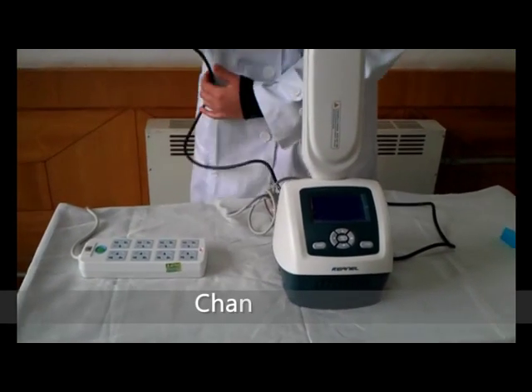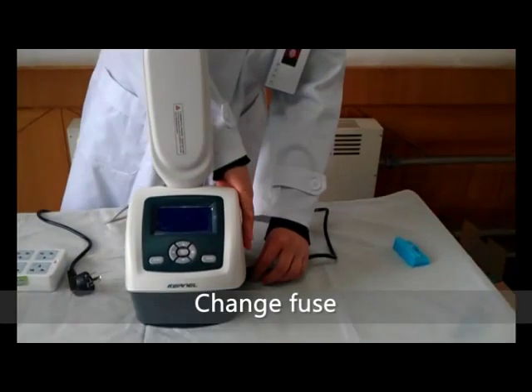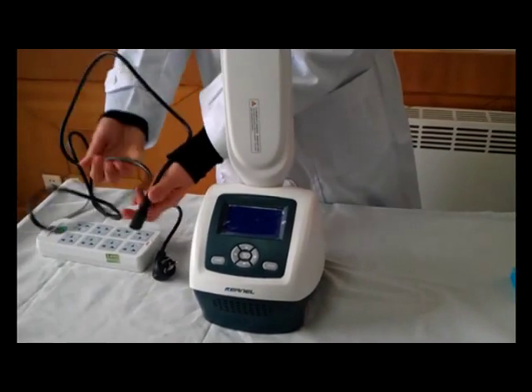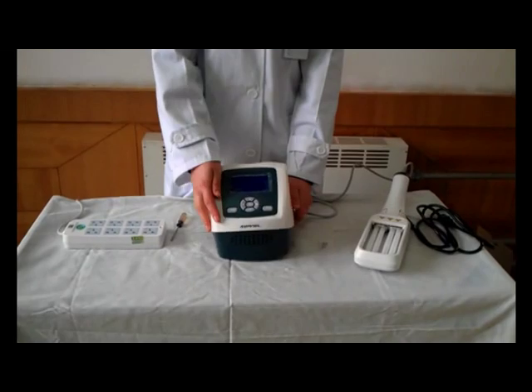Next, we introduce the fuse replacement method. Please disconnect the power supply before replacing. Use fuses of the specified specifications.